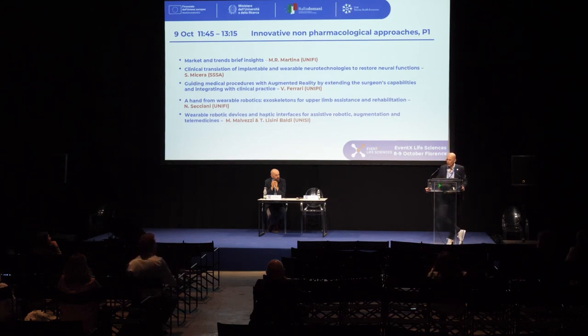No. Thanks for your question. The answer is that it depends on the available source of intraoperative imaging. For example, as I showed before, now we are improving the registration using 3D intraoperative cone-beam CT, but the acquisition of an intraoperative cone-beam CT in this case means the acquisition of 720 X-ray images for each volume. That means that we can acquire just a volume up to 2 for the entire intervention. So in any case, it is not a real-time image.